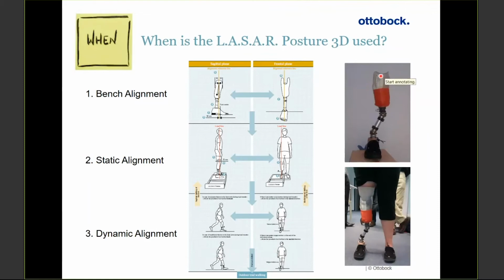So you can see here the little dotted line is the alignment reference line passing down through to the center of the foot. So it doesn't matter which way the pylon is leaning, as long as the forces are being transferred at the correct place.